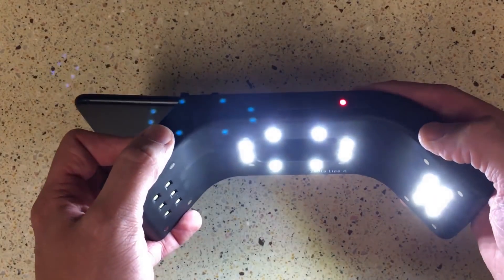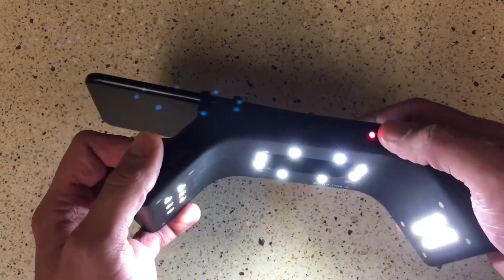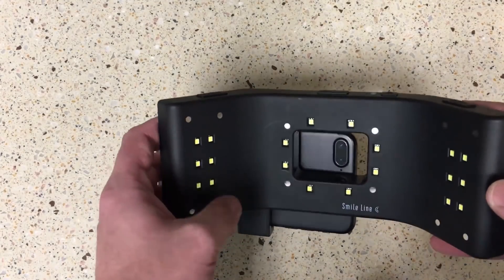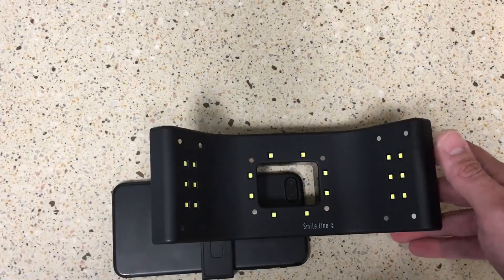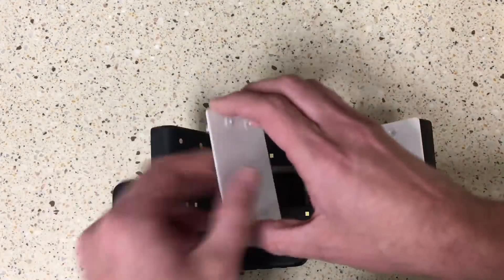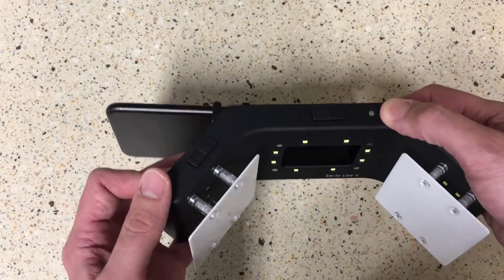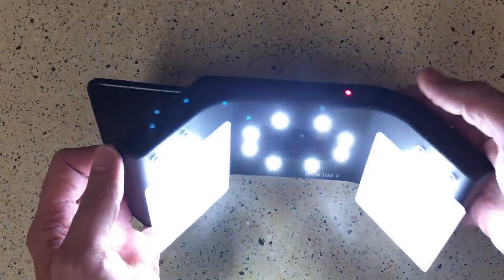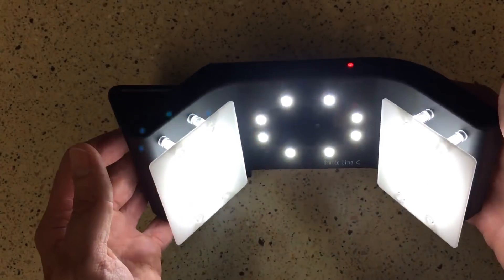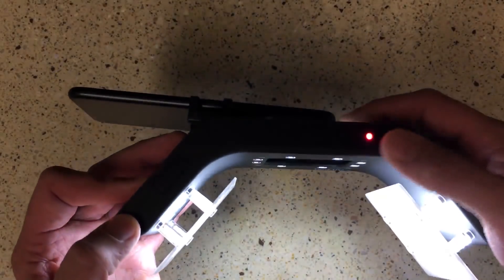Another cool thing about this light setup is it comes with diffusers. There are little magnets here on each side, and you can take these light diffusers and just pop them on magnetically on each side to get a really nice photograph. That is going to help diffuse the light coming from the sides to give you a really nice shade-corrected photograph for your anteriors.